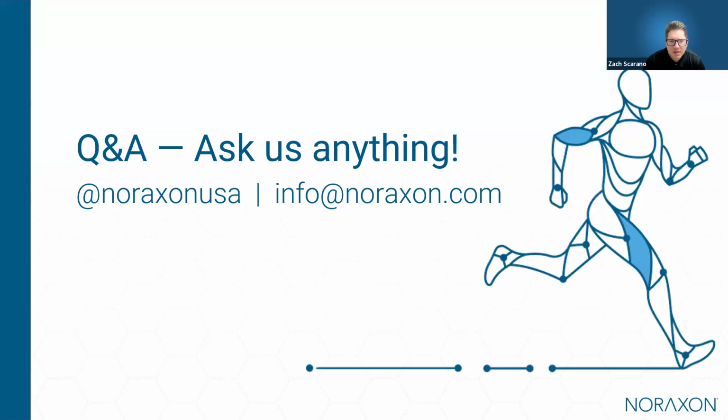Second follow-up: will the app be compatible with other devices in the same way as the standard Noraxon software? And attached to that, there have been some questions about whether there is an integration with IMUs. No, this app is specifically for EMG biofeedback at the moment.